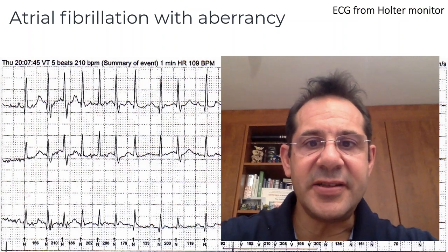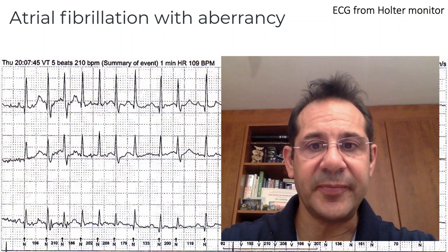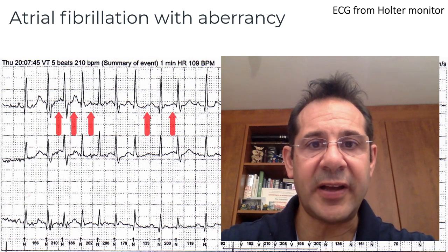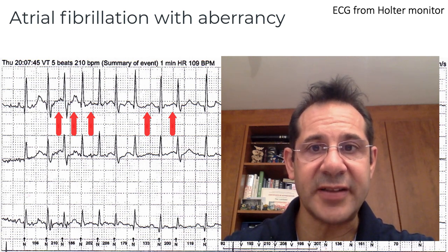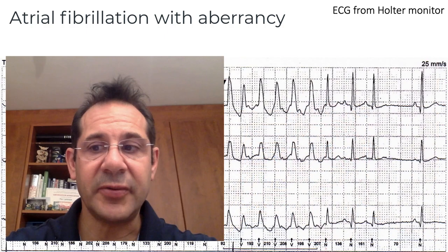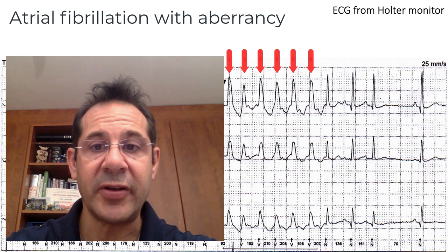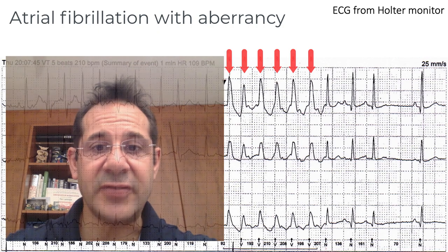This is an ECG recording of atrial fibrillation with aberrancy. You'll see during the recording that there are irregular wavy lines between the QRS complexes. These irregular wavy lines are atrial fibrillation activity — irregular electrical activity in the top chamber of the heart. Towards the end of the tracing, the beats are broad rather than narrow because electricity is moving more slowly through the heart, caused by the irregularity of the atrial fibrillation.